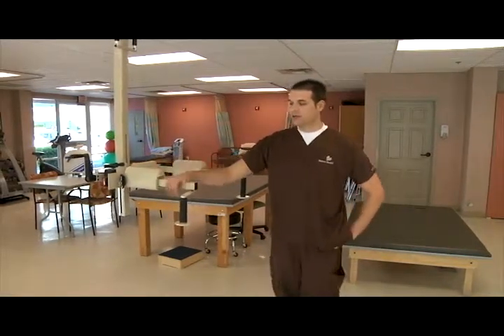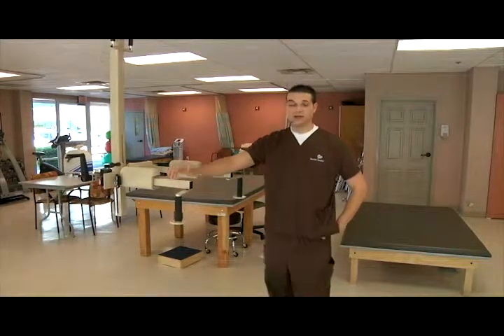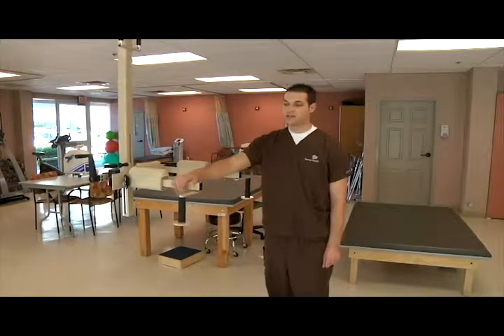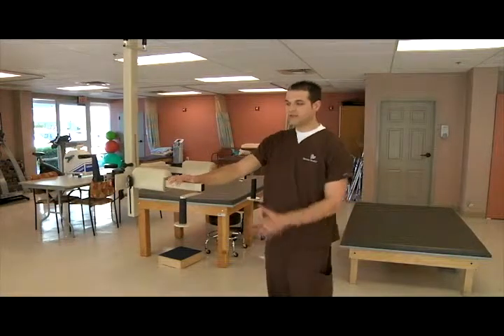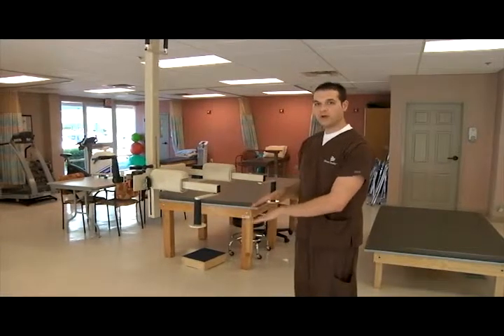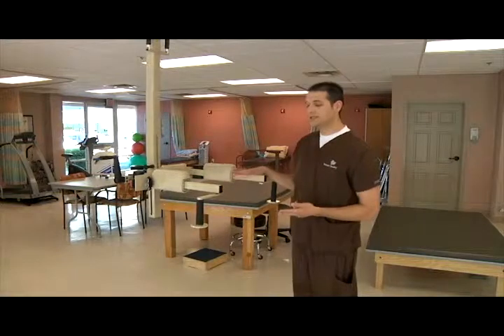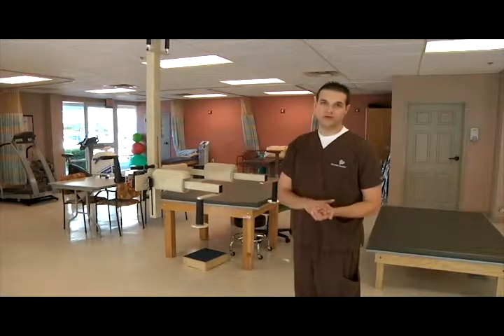We use it on total knee replacements and hip replacements, our elective surgeries, and we use the SecureTrack twice a day, and that's to help get the patients to heal faster, quicker. The idea behind the SecureTrack is that it helps put weight through your legs. So if we're able to get you up sooner or get you up twice a day using this device, it's going to force you to put more weight through the leg twice a day, which in turn is going to make the bone grow, which in turn is going to make you heal faster, which in turn is going to get you off the walker faster, okay?